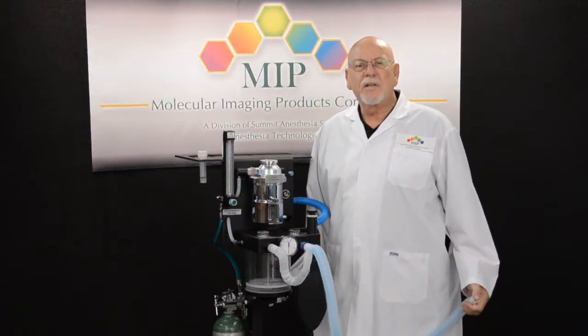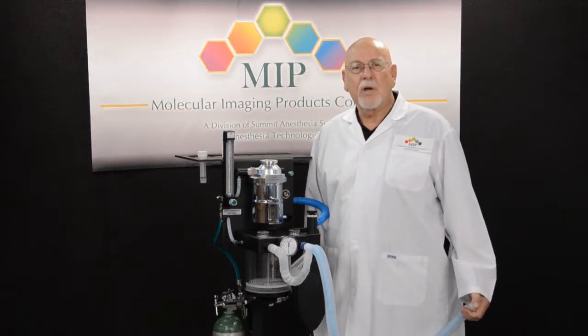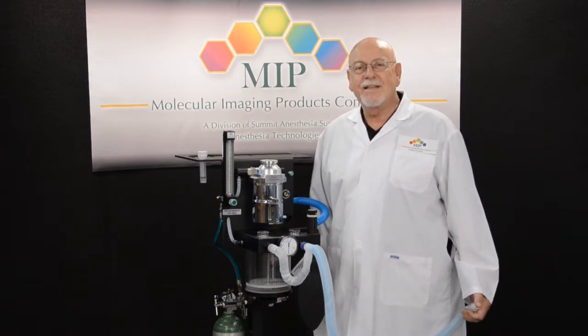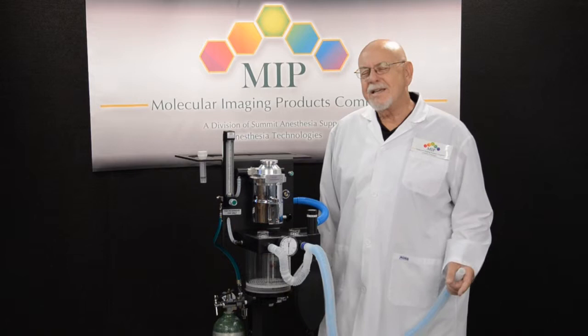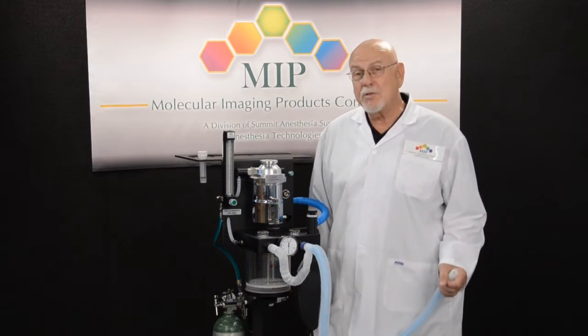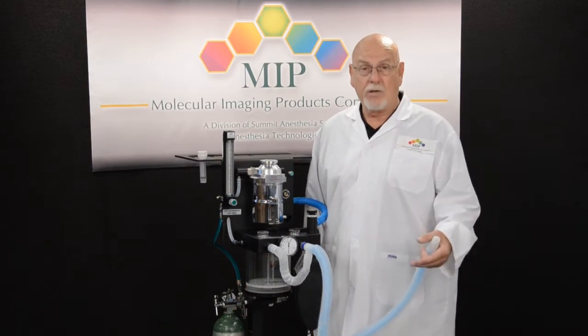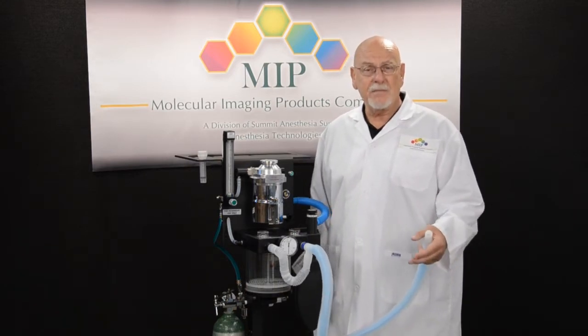My name is Jim Houts. I'm president of Molecular Imaging Products Company in Bend, Oregon. I'd like to demonstrate the 10-second test to you. The 10-second test is probably the single most important test that the user of the anesthesia device can do before you have the animal hooked up on the anesthesia machine.